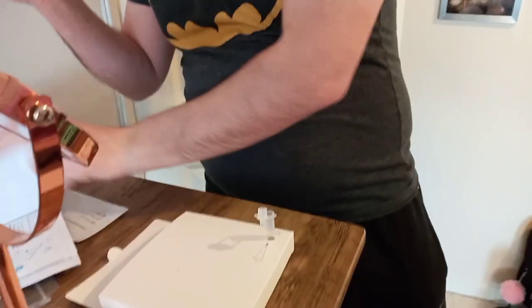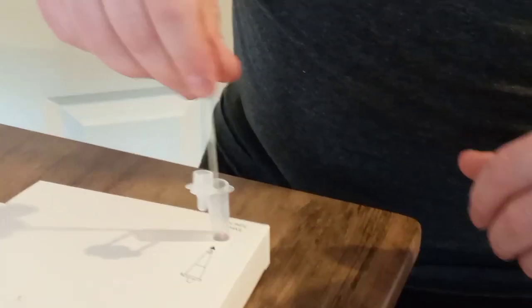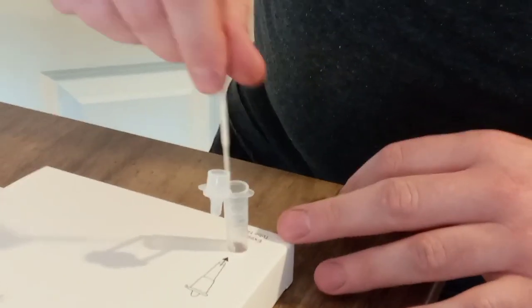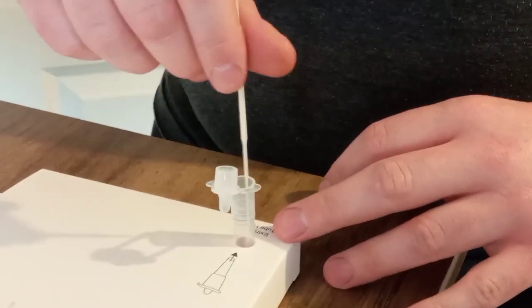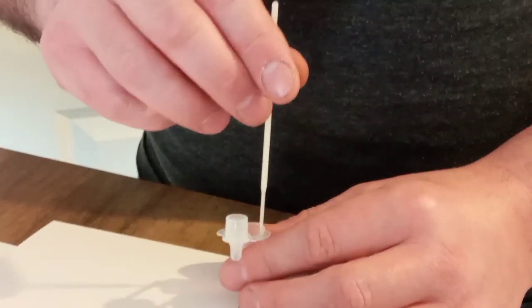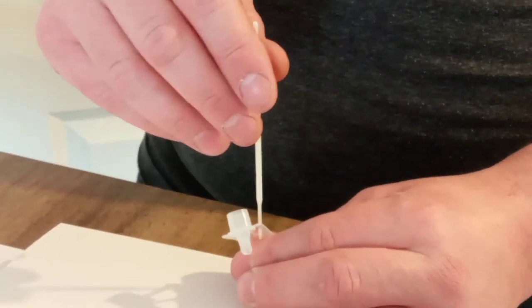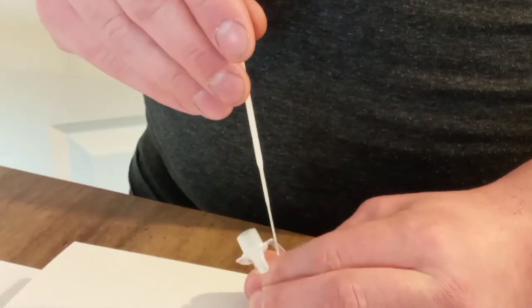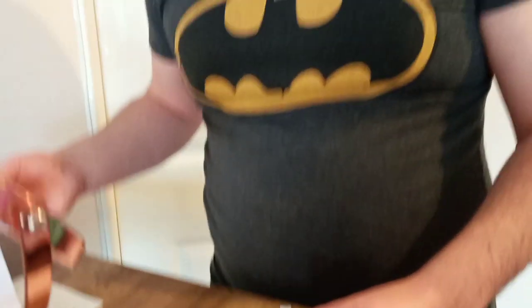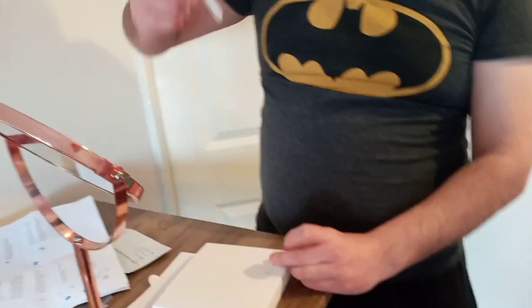So we then put this in here and swirl it about a bit. It says pinch the extraction tube against the wall as you move up — so I pinch it and pull up. Press the cap on, push the cap on. So it's just this little bit on the bottom, it appears.